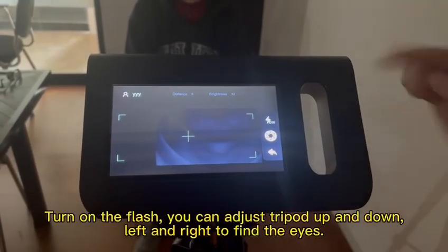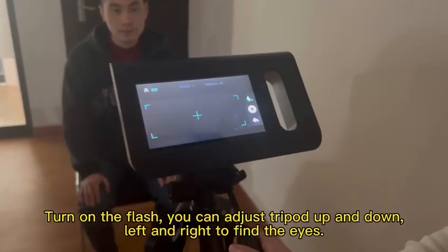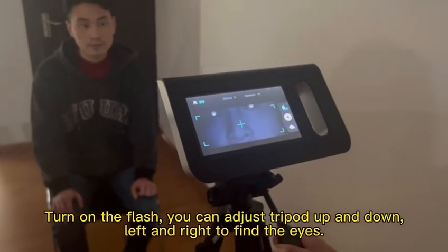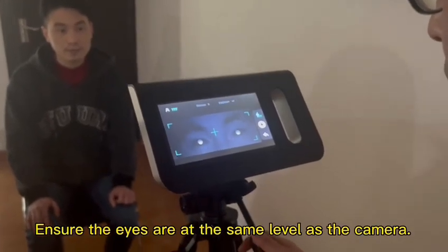Turn on the flash. You can adjust the tripod up and down, left and right to find the eyes. Ensure the eyes are at the same level as the camera.